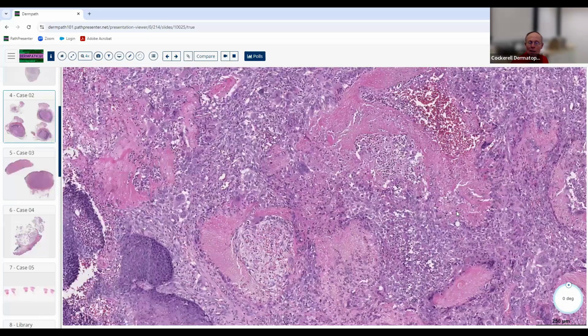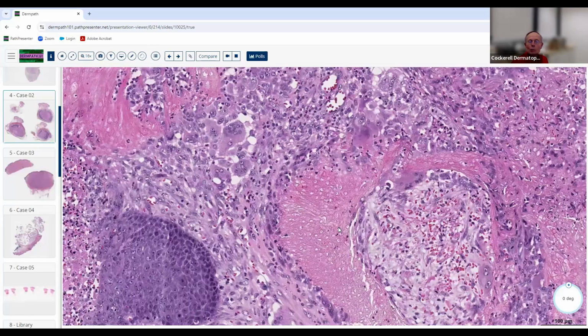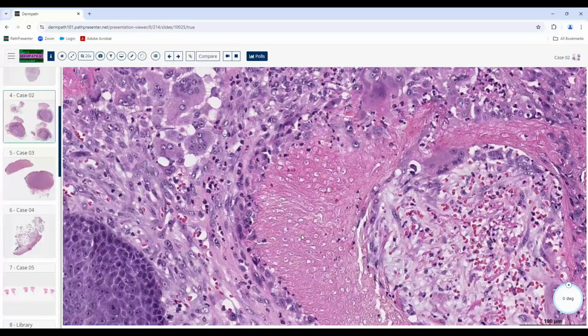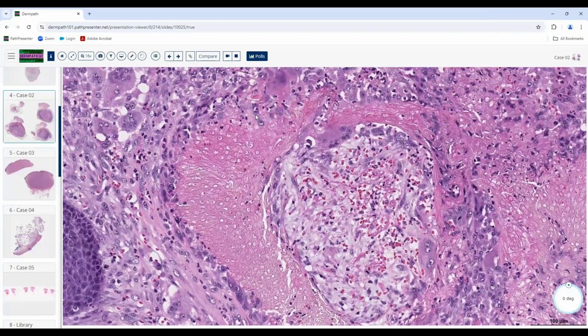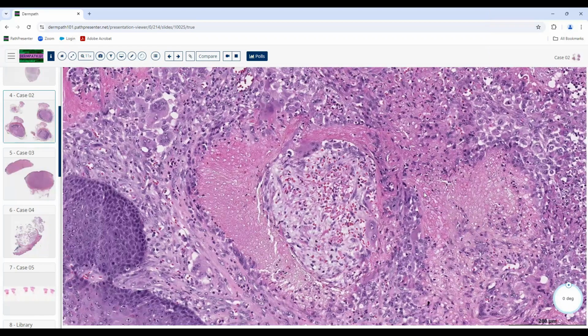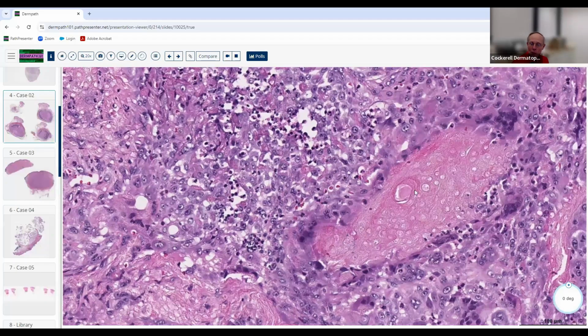Okay, so you've decided this is a benign adnexal neoplasm. It's got matrical differentiation. Does it have anything else in here that helps you with the diagnosis? Yeah, so those pink amorphous areas have the empty nuclei, the ghost cell appearance. What do we call those cells there? Ghost cells, shadow cells? Shadow cells, yeah. I guess you can call them ghost cells. It's getting close to Halloween, so may as well use that term too if you want. But yes, these are the so-called shadow cells.